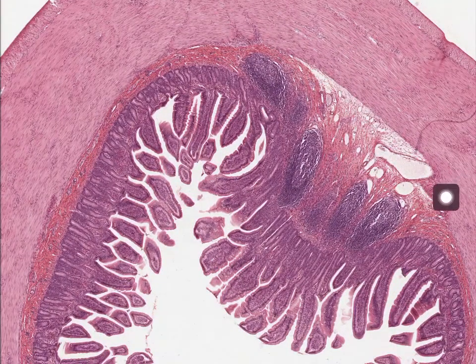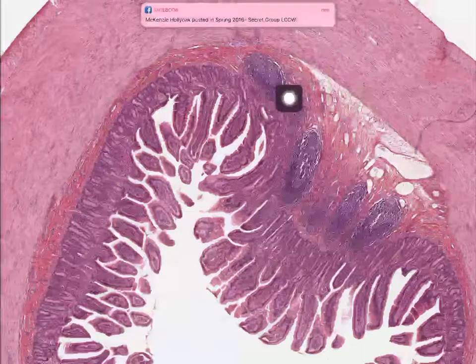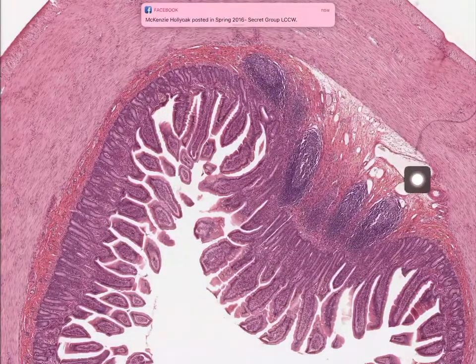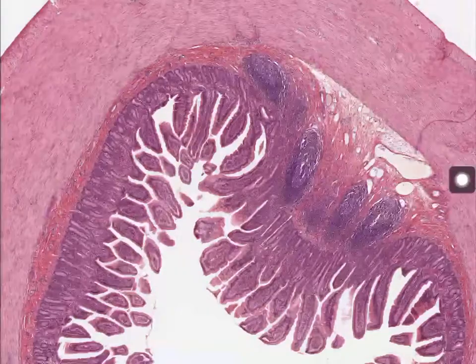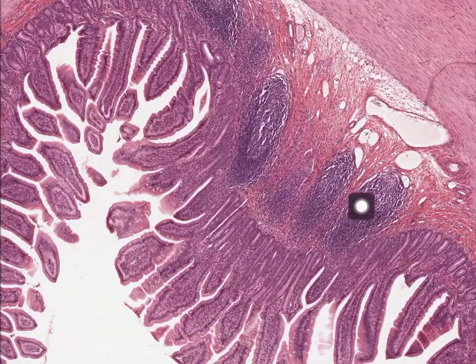However, what you do see are these secondary lymph follicles. Do you guys see that when I'm outlining right there? There's one, there's another. Here's one right here, this one, this guy, this guy. You guys see that? These are all the submucosal glands. I'm sorry, not submucosal glands. These are all secondary lymph follicles, okay? We call these secondary lymph follicles Peyer's patches, all right?